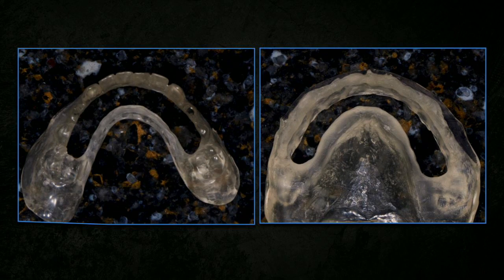And we would basically make a duplicate of the denture and create a trough, much like this.